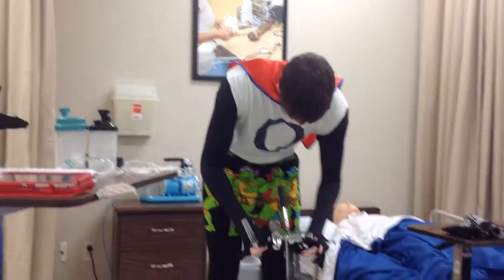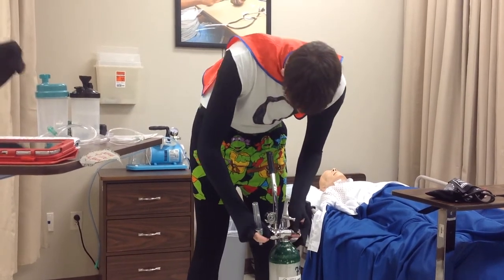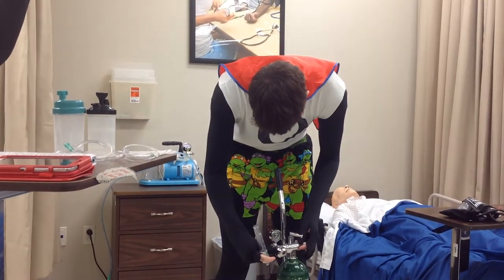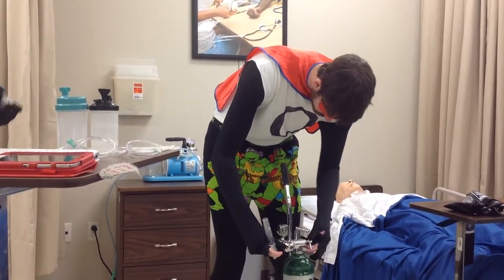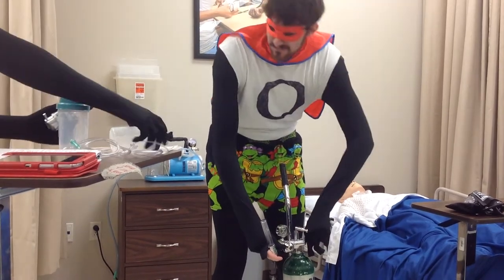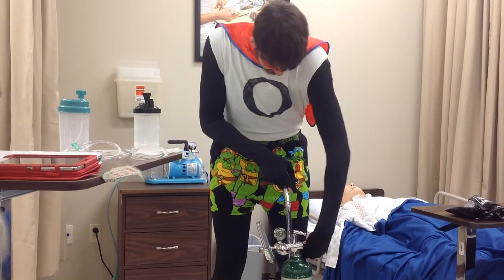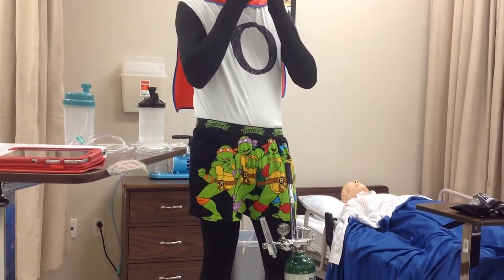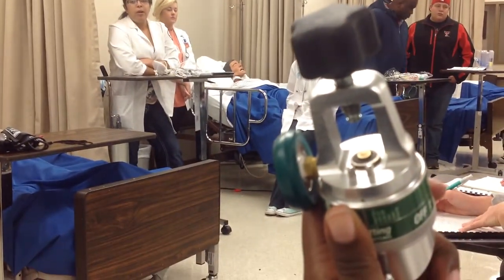Once you've chosen your regulator, you're going to put it on your oxygen tank. One side of the regulator has prongs. It's kind of hard to see right here, but you want to make sure it's on the side with the holes that correspond to the prongs on the oxygen tank. You can see the prongs right there, along with the gauges and dials. The prongs go on the side with the two holes on it, as you'll see when you're looking at your oxygen tank.